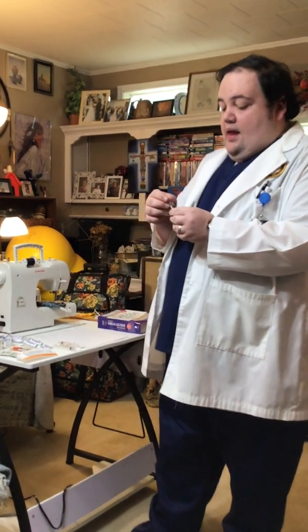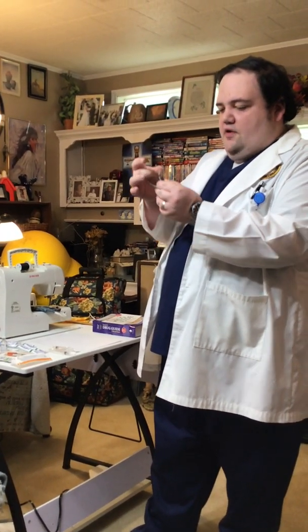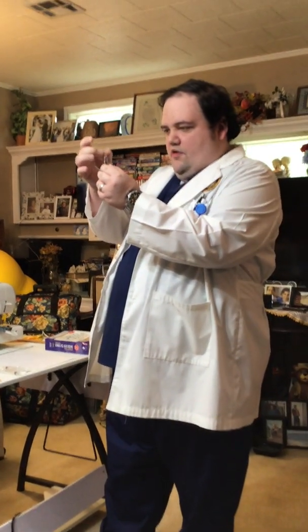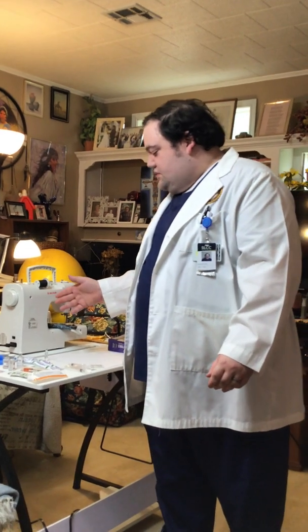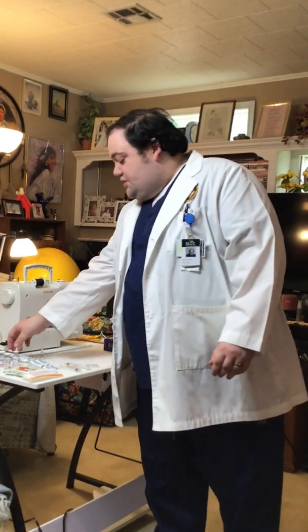All right. And there are some different things that you have to do when it comes to an ampule versus a vial. The first thing I'm going to do here is make sure all of the medication drops from the top of this tip, because I'm going to break the tip off, and I need all of the medication to stay at the bottom. All right, I'm going to prepare my needle. This iron dextran is going to be administered as an intramuscular Z-track medication.